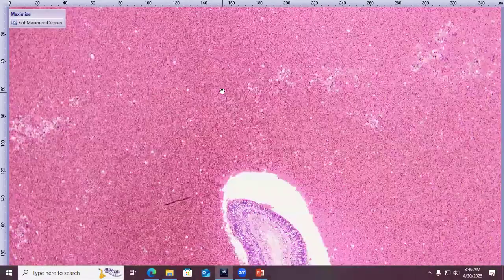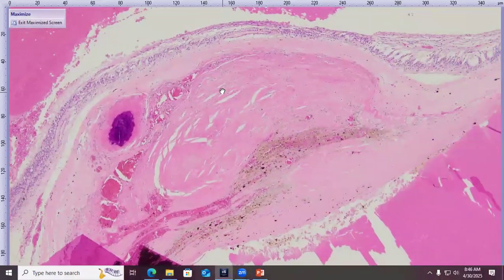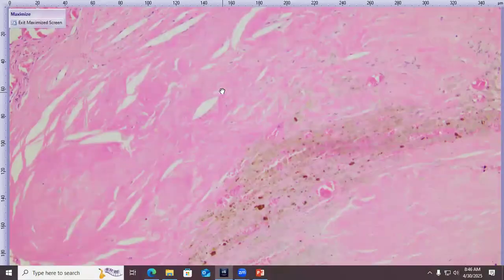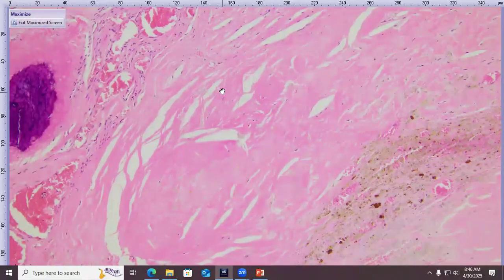So like I said, this is most likely persistent fetal vasculature. This plaque of vessels and collagenous stuff on the back of the lens with the intraocular hemorrhage. I'll point to that condition. It's a congenital anomaly in dogs that is basically failure of the normal regression of the primary vitreous body and the hyaloid vasculature.